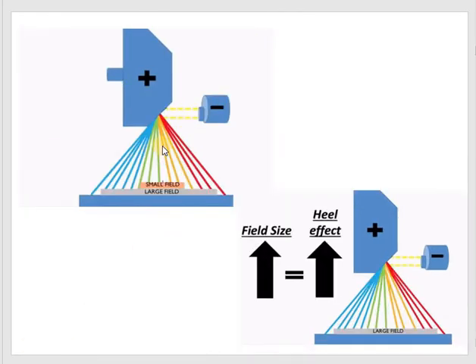And the other physical method to overcome this is by using a much smaller field size. This is done via collimation and so on. If you have a small field size of that particular region of interest, your field size will only receive intensity from this intensity up to this intensity, and this is the central ray.